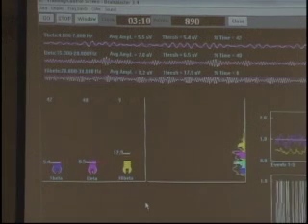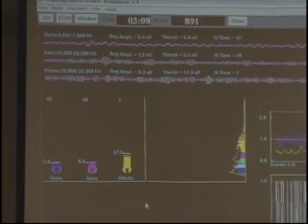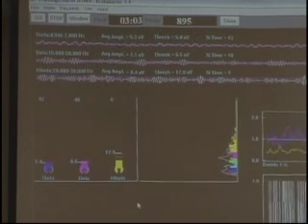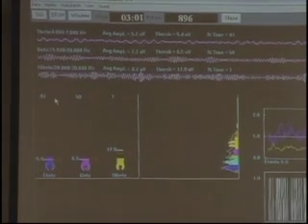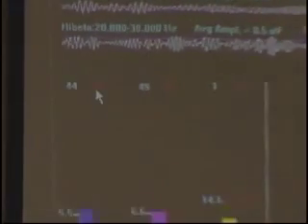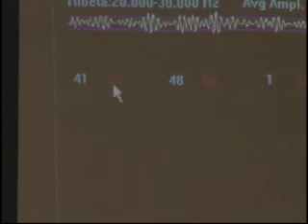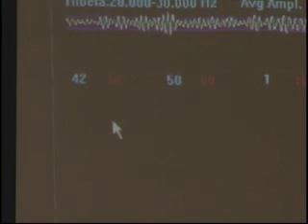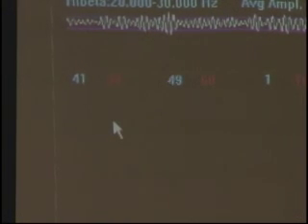Let's say that instead of 20% time above threshold for theta, we said it's too easy — I'm going to make it a little harder. If I take my T key for theta and push it, see the 20, 27, 28, 29, 30 — see how I just changed the percentage to 30 as my target? You're just pressing the T key? Correct. Where is it showing us? On the thermometer, the red thermometer as the target — up at the top. Take it to 30. Did the feedback change yet? It's going down.